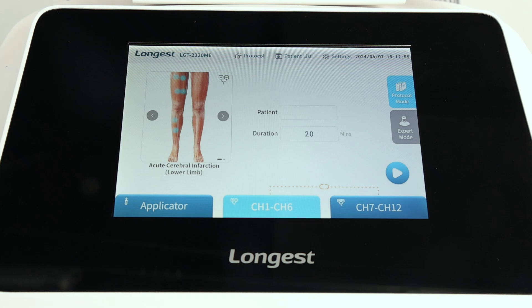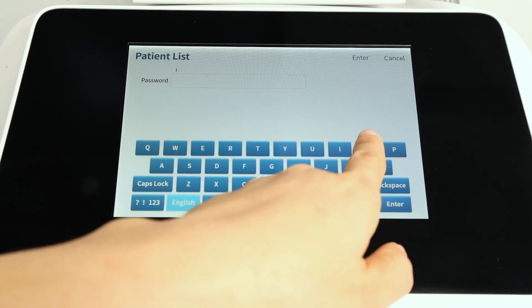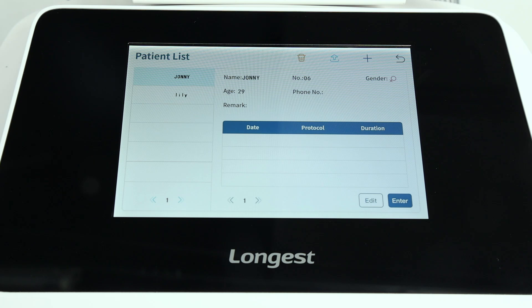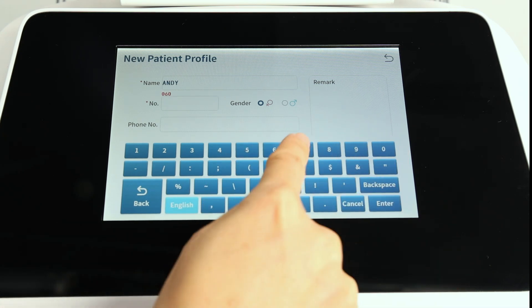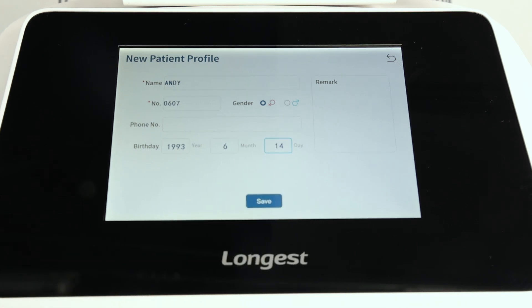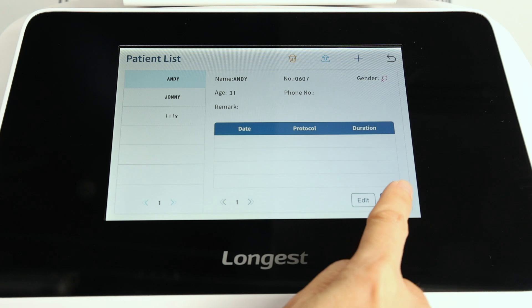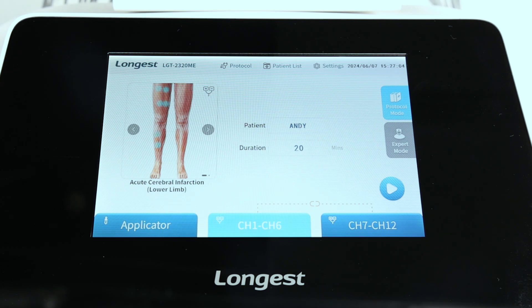First, bind the client profile. On the main page, click the client list button and enter the password to visit the client list. In the client list interface, you can add a new client profile. Click enter to bind it to the treatment. There are two channel groups for electrode pad treatment — choose the right channel group according to the electrodes you attach to the patient.